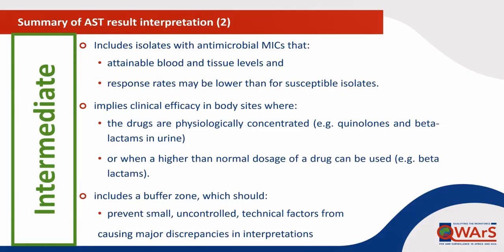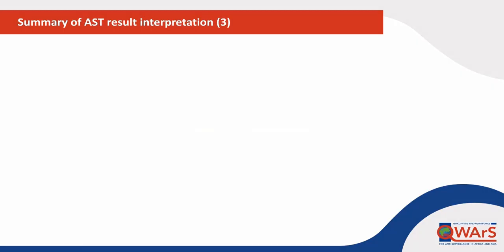This category also includes a buffer zone, which should prevent small, uncontrolled technical factors from causing major discrepancies in interpretations, especially for drugs with narrow therapeutic margins.